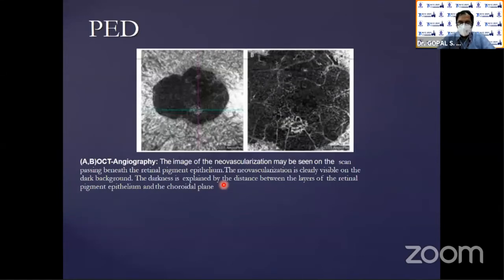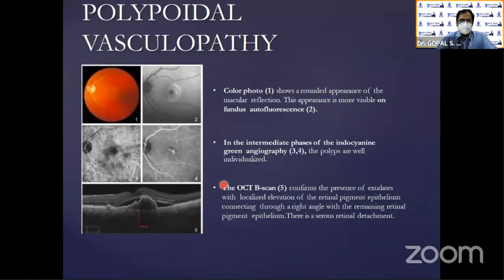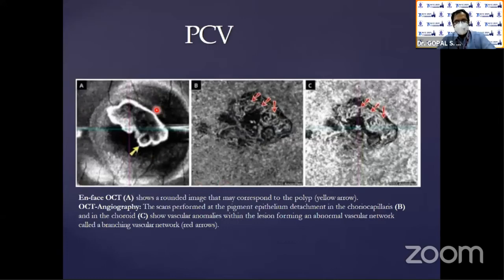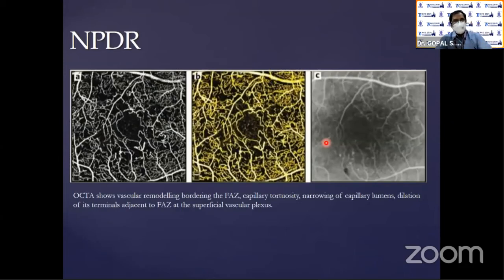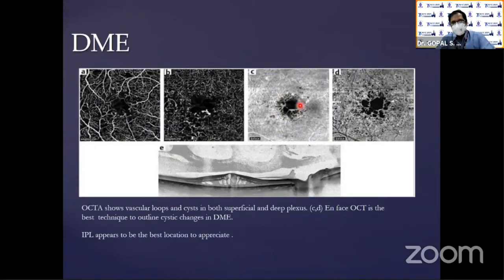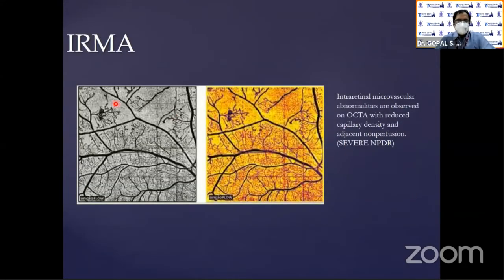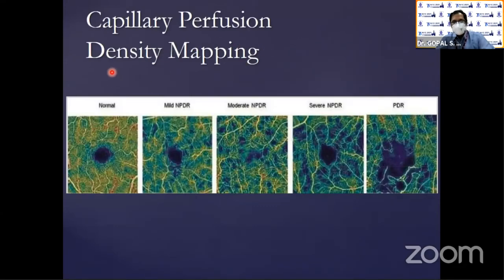A pigment epithelial detachment can look like a flow void, but always correlate with the structural OCT. OCT angiography findings must be validated through the corresponding OCT. In polypoidal choroidal vasculopathy, you can see the polyps — multiple polyps, sometimes on either side. In non-proliferative diabetic retinopathy, you can see microaneurisms — also visible in OCT angiography. In diabetic macular edema, you can see the cystoid nature of the cysts, the location of leakages and microaneurisms. IRMA can also be seen with ischemia and new proliferation. The capillary perfusion map shows the normal central area versus breakage of the capillary plexus as the retina progresses from moderate NPDR to PDR.